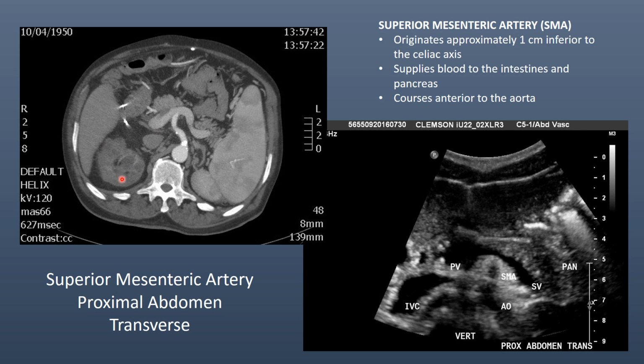Okay, I want to point out the right kidney, a portion of the left kidney, a portion of the liver, and we have bowel, some bowel gas. I'm going to move to the ultrasound image. Okay, patient's right, left, anterior aspect, posterior aspect. This portion of the liver here. And we'll go back. We have the vertebral body with the shadow behind it. Have the aorta in transverse view.